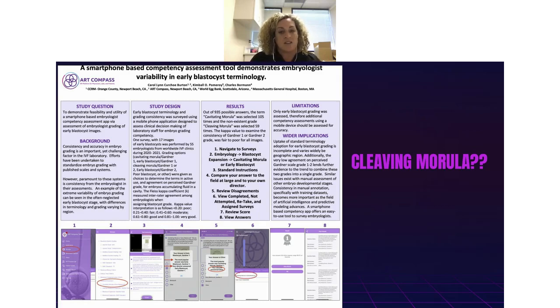We moved on to taking a survey of embryologists to see what sort of terminology was in use for early blastocysts. So this we presented at PCRS last year. And would you believe that some of your embryologists in your lab would pick terms that don't exist to grade early blastocysts with? Because we did receive multiple answers back for the faux term that we put into the survey, which was cleaving morula.